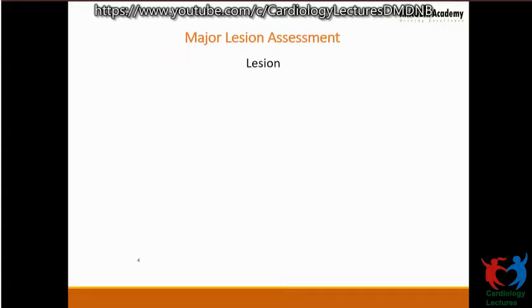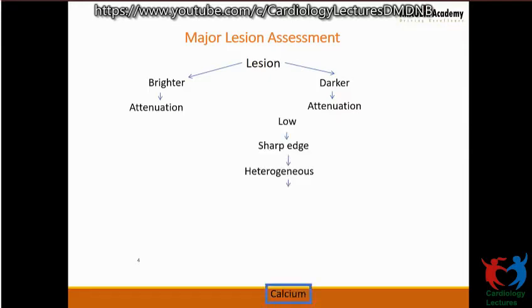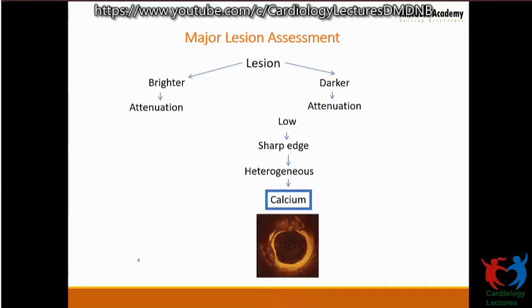Now the major lesion types. We generally use two things, backscatter and attenuation, because it's a light-based technology. If you have a backscatter, the lesion is going to appear very bright. You also look for attenuation. If the attenuation is low and it has very sharp edges and is heterogeneous, then what you have is calcium. It looks very sleek, well-defined. And if one has seen a calcific plaque in a coronary, one will never forget it.